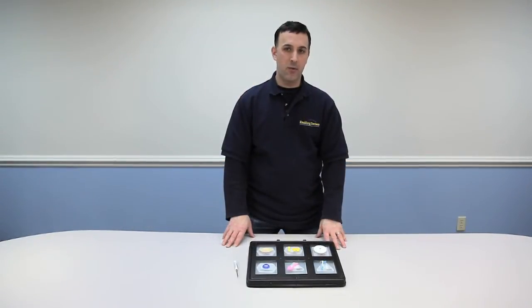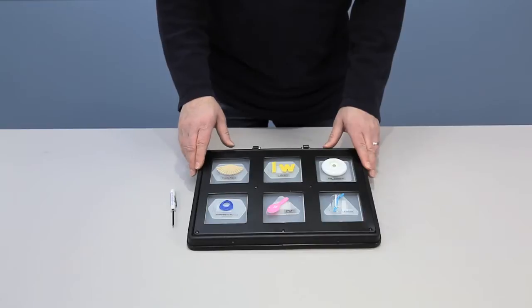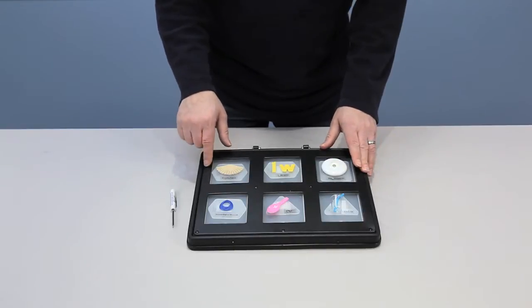Hi, this is Vinny Lavoie from Enabling Devices tech support. Today I'd like to talk to you about our number 4040 Symbol Communicator for the visually impaired. Let's get started. This communication device will allow you to record a set of six messages.